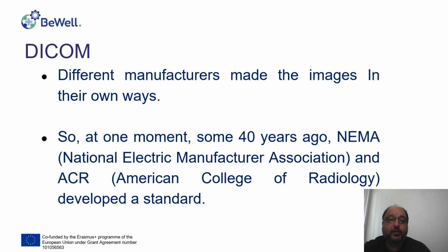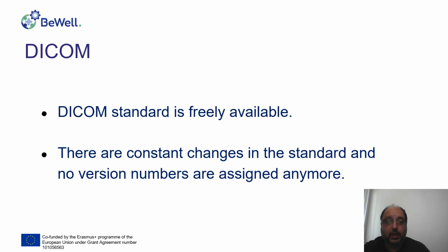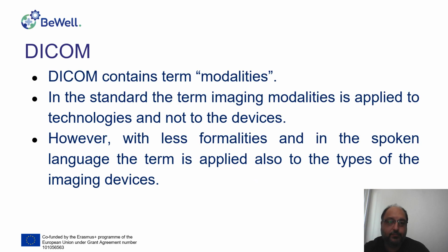So some 40 years ago, the National Electric Manufacturers Association and American College of Radiology developed the standard and called the standard DICOM. Unlike many other standards, the DICOM standard is freely available and everyone has free access to it. Because there are constant changes in the standard, it was decided some time ago there will not be versions assigned to it, and the current version is the only version.